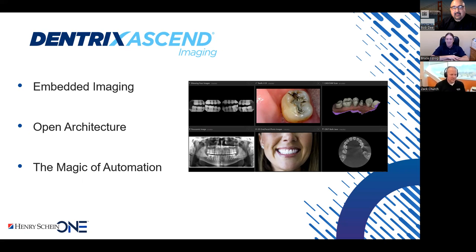And I always recommend to people, when you're choosing a software, look at imaging before you look at the reports. See how images are handled. I can't do dentistry without imaging. I don't care how many reports I create. If my x-ray doesn't look good, if it doesn't have embedded imaging, this is really important. Embedded means it's within the software. Nothing else opens up, correct? That is correct. Yeah, and we'll tell you all about why. There's no bridged solution that you have to get out to a separate application with separate look and feel, separate access rights, and we'll go into that in a little bit.